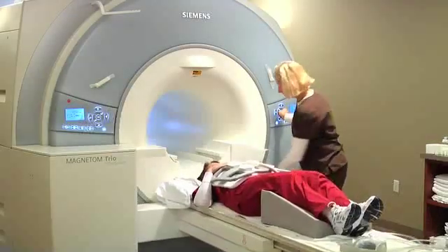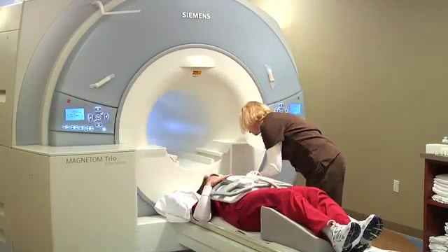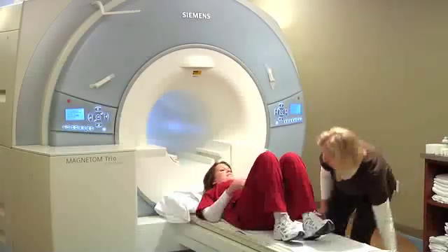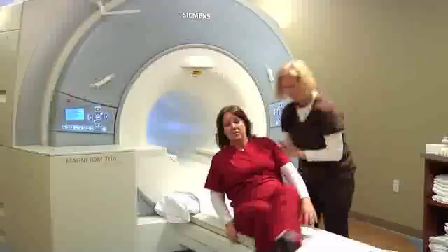Once the scan is complete, the technologist will re-enter the room, slide you out of the scanner, lower the table, and take the coil off. Once the coil is removed, we'll help you off the table and you're free to go back to your locker and change back into your clothes.